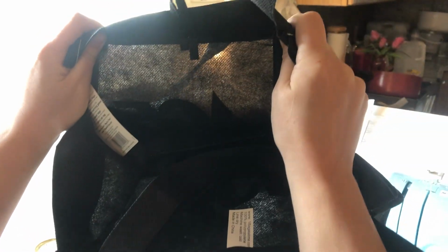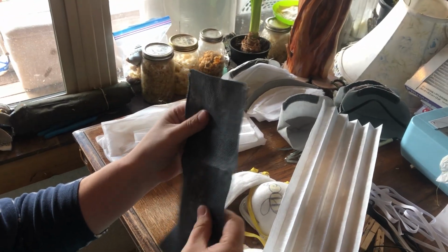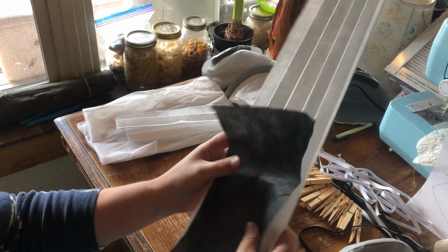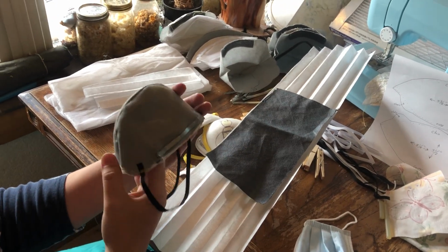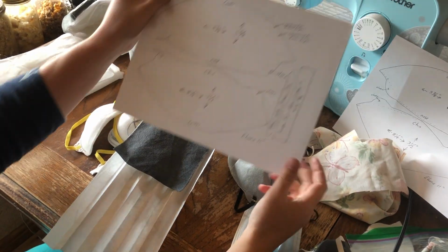No holes. We don't want any little holes. Somebody online was saying the more you sew through it, the more holes you make. That's not good either. And I was like, well, that makes sense. So since I had to make a pattern to make a cone shape, because I can't press one, that means you're going to have seams. It's like, okay, well, I got seams. What am I going to do? So first off, here's my pattern.